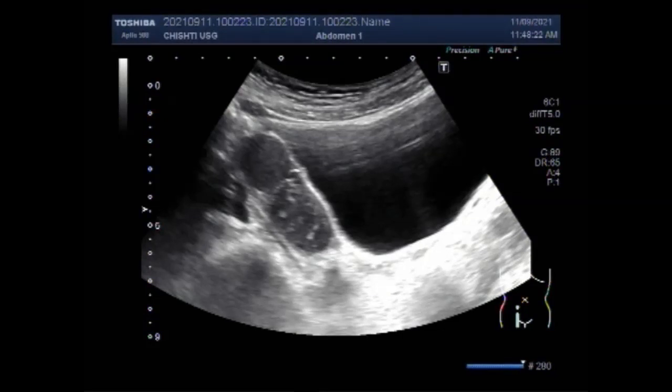Dear viewers, I hope you are all fine. This ultrasound video shows a case of uterine didelphys with primary amenorrhea.